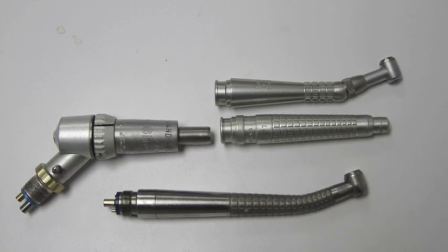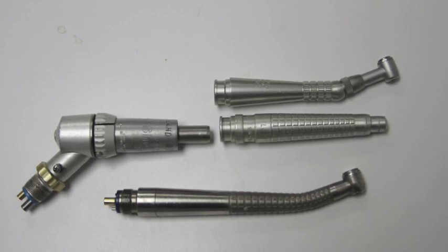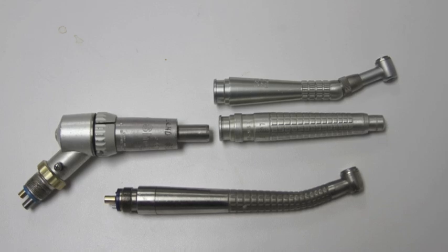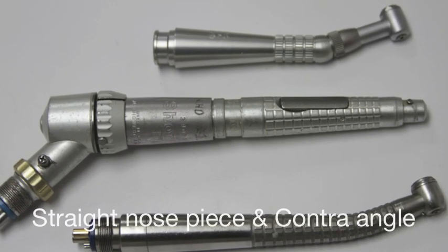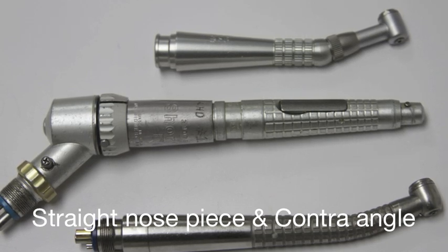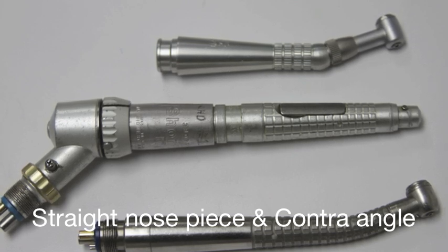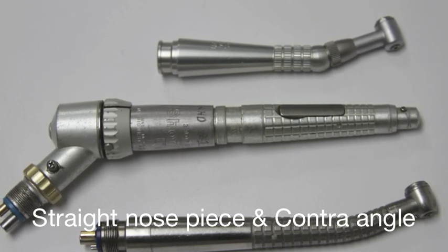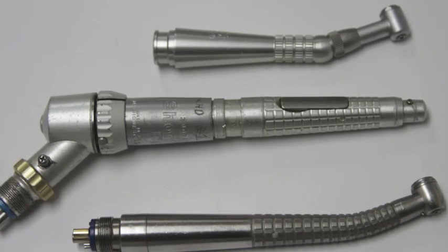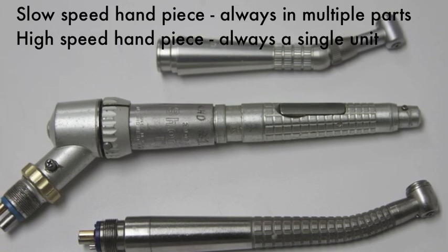Slow speeds consist of two parts: the motor, seen on the left, and the heads, seen on the right and above. The contra-angle head and the straight nose piece are used for different kinds of burrs and have very different functions. Typically, the contra-angle will be used inside the mouth, and very often the straight nose piece will use larger burrs which are used outside the mouth, such as for trimming dentures.